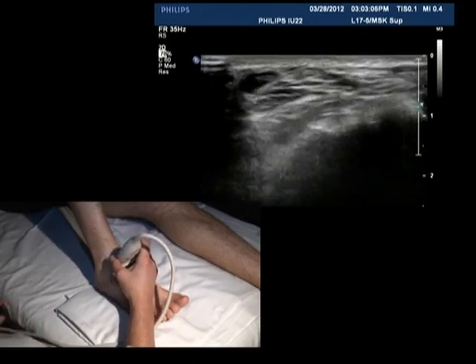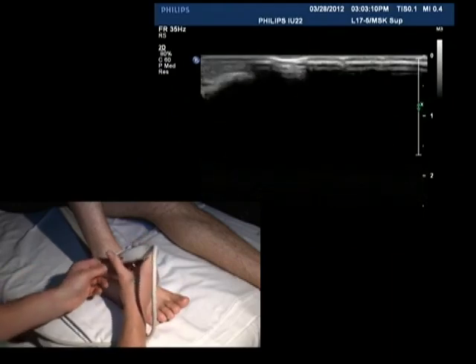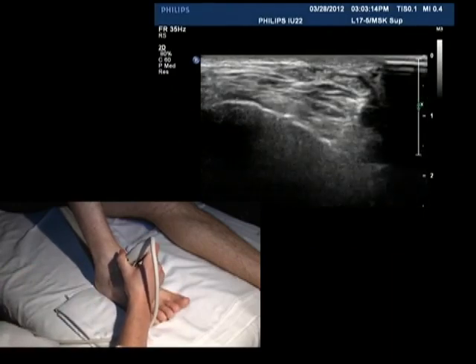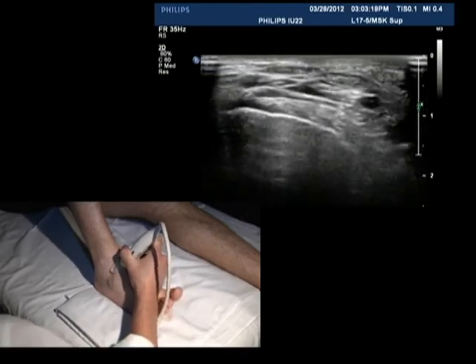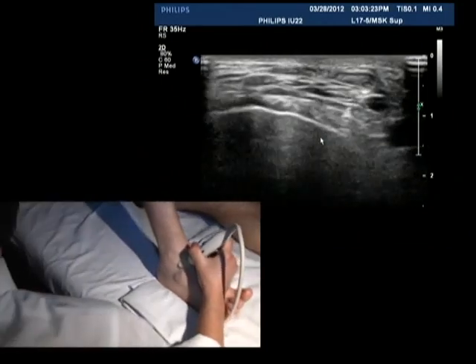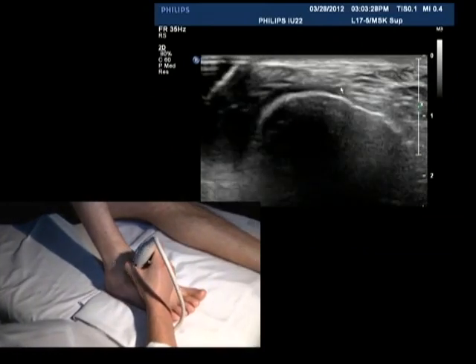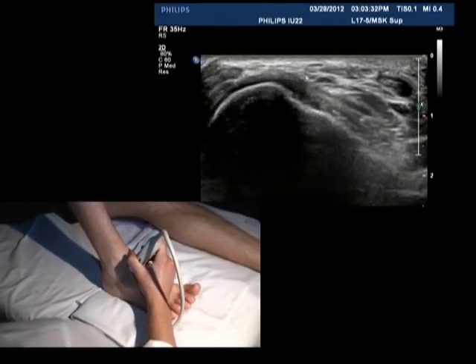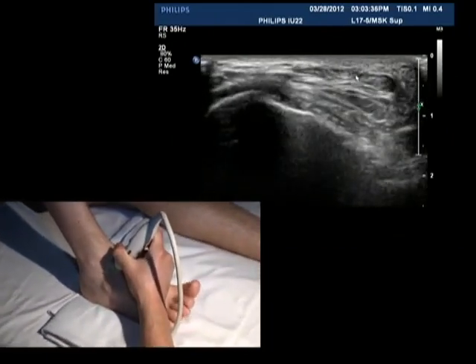So you know the one, sorry, let me flip this around. You know the one right next to it. Go ahead and keep moving your great toe there. So you know the one right next to it is the extensor. Remember, it's Tom hates Dick or Tom hugs Dick. You can see that, oh, that's great. So we can see the tibialis anterior here. As he moves the toe, go ahead and move your toe. You can see this one moving, extensor hallucis longus and extensor digitorum longus.